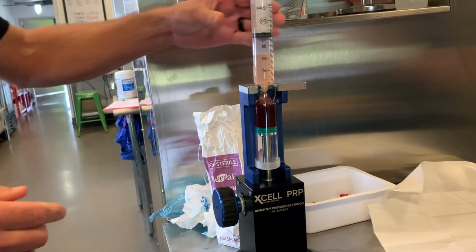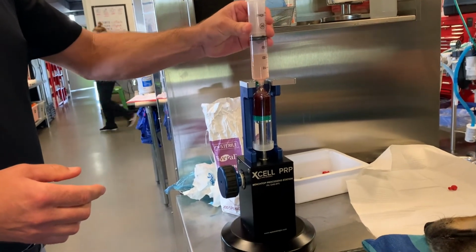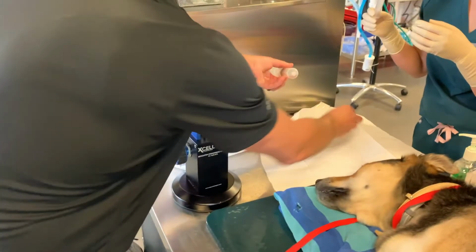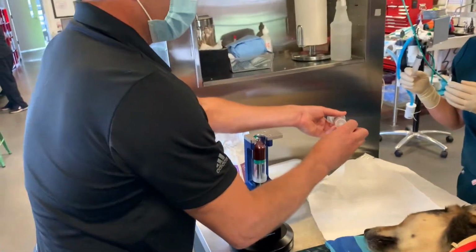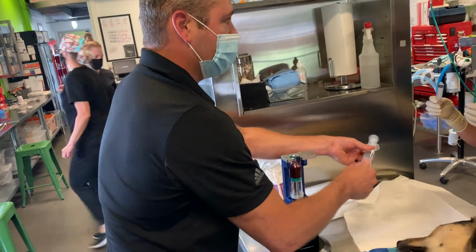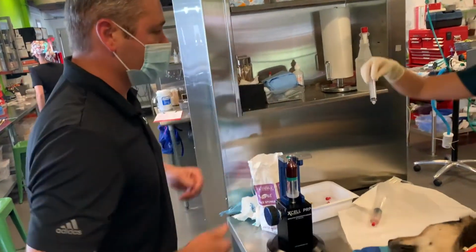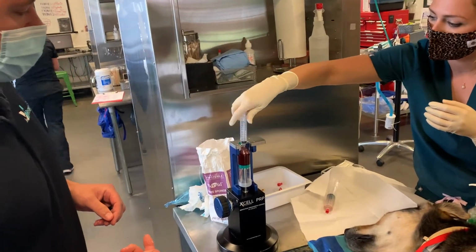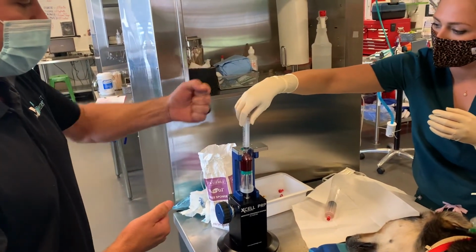Okay. So at this point, this is all platelet poor plasma. Yep, this is your platelet poor. Okay, and you just cap this off and dispose of it. Or if you're doing a protein concentrate, you would keep it and then use that to filter down for your protein concentrate. I'm going to do, so just put that on. Yes. And you just push down.